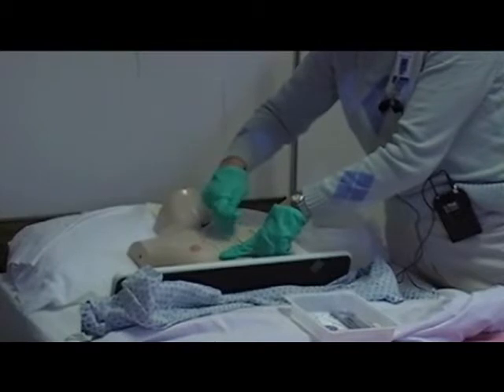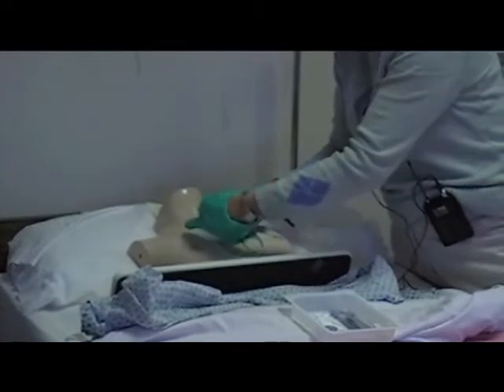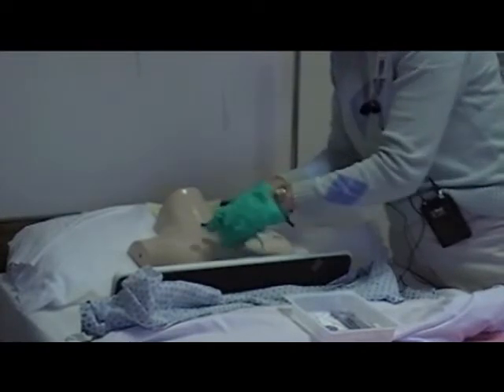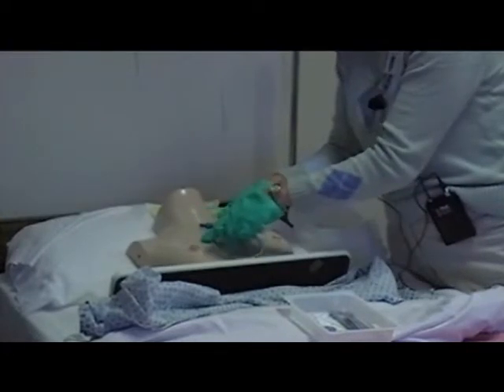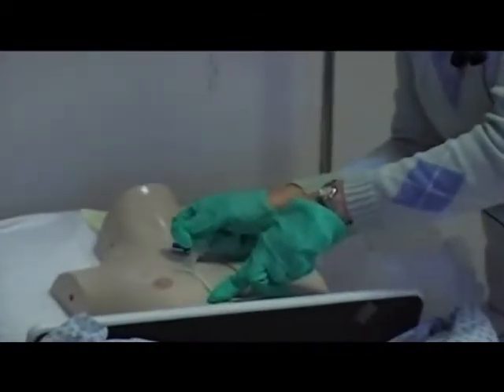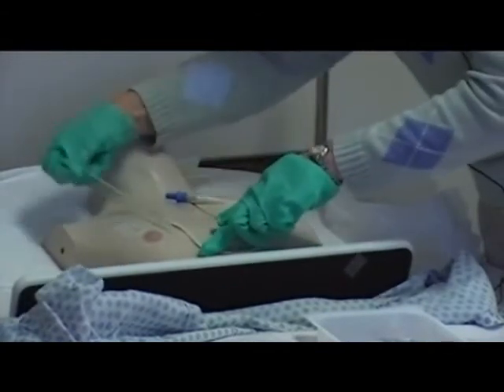And as I pull it off also, I want to go towards the insertion site. Look at the path which the catheter was inserted at. That's the direction that I pull the dressing towards. Because if I were to come down this way, it is feasible that I could actually pull that catheter out. So I go towards. And I do not want the dressing that I'm taking off to go back on this area underneath, which would be considered a sterile area.